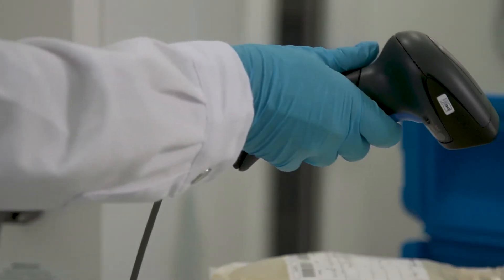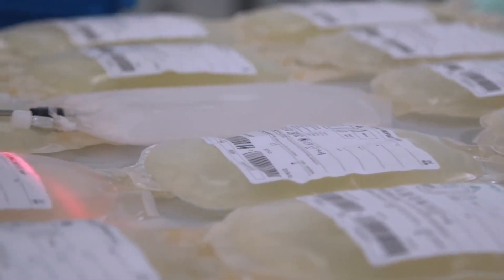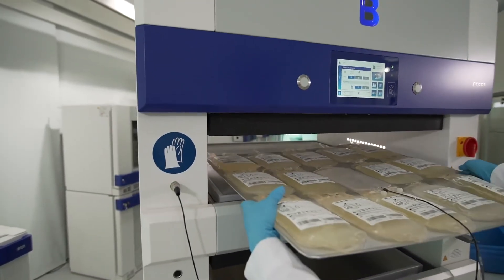Always start loading in the centre of the plate. The bags shall not overlap each other, but freezing in double layer is allowed. Once the freezing plate is ready to operate, place the tray inside the CSF.